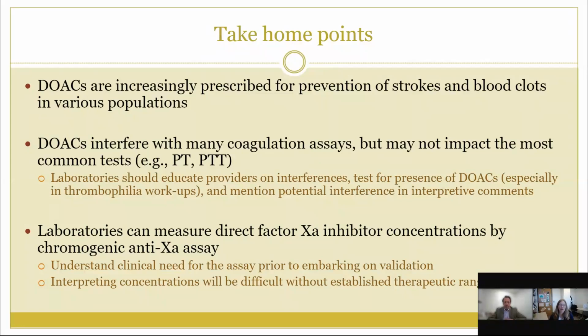And so we want to make sure that with the removal of DOACs, can we still reliably detect lupus anticoagulants? Does it change our ability to detect those? Does it change the stability of a lupus anticoagulant in a sample? Because we batch these samples and they might be sitting in the freezer for a couple of days. So does the use of the neutralization agent change any of that?